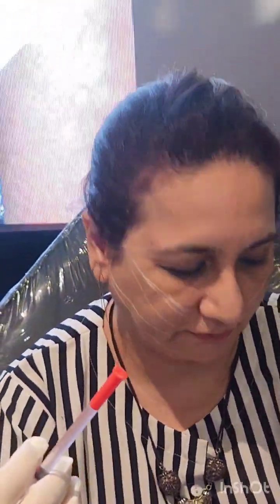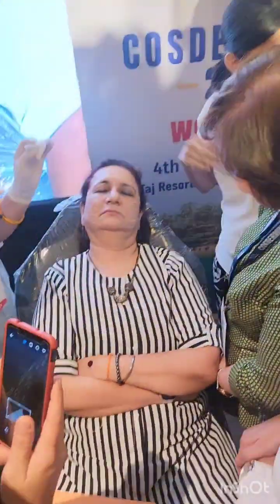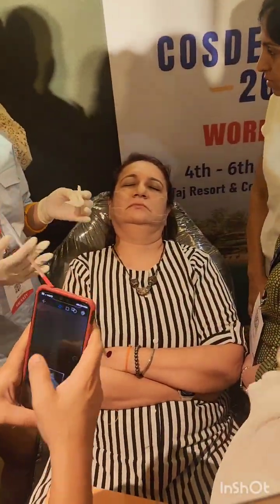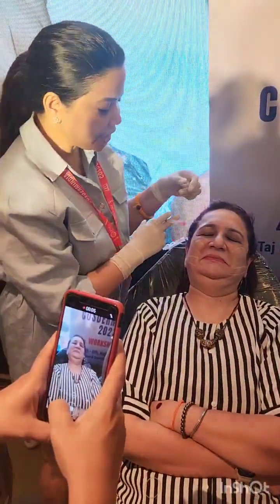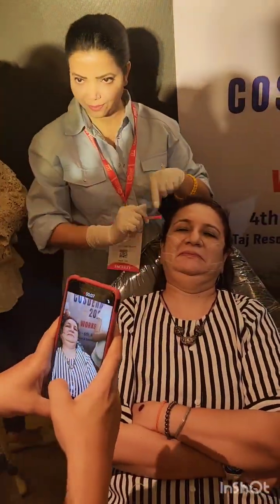That is what I was telling you. Because when we are putting it like that, we have this issue from this way. Whereas if the patient is lying in 30 degree or 45 degree position, that's the best position for thread as compared to fillers, because in fillers, 90 degree upright position is used. Here we are okay with the patient in supine position, because we pull in the pressure.